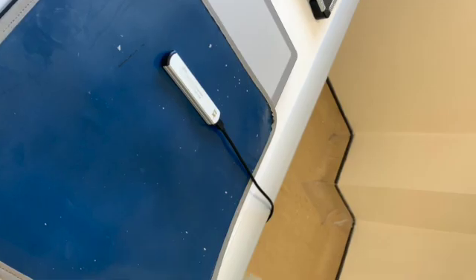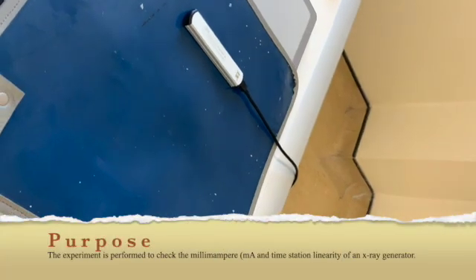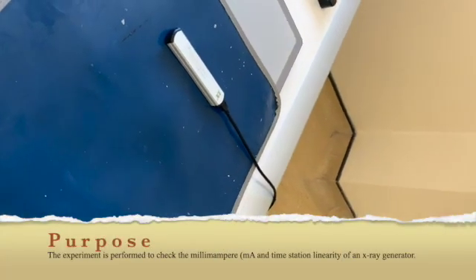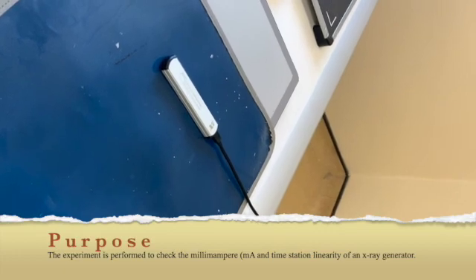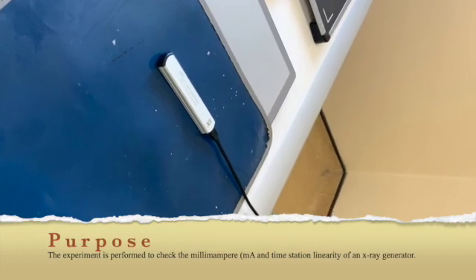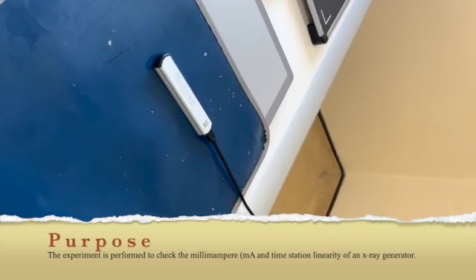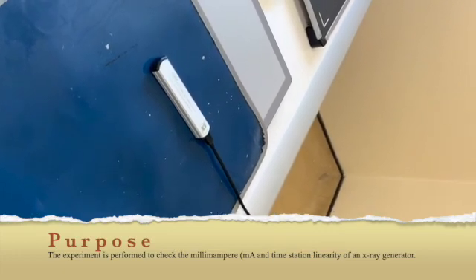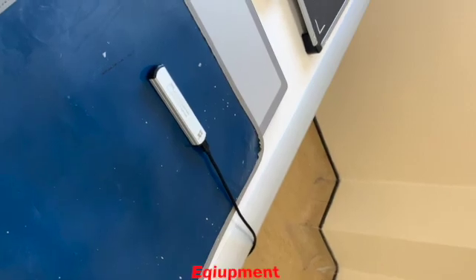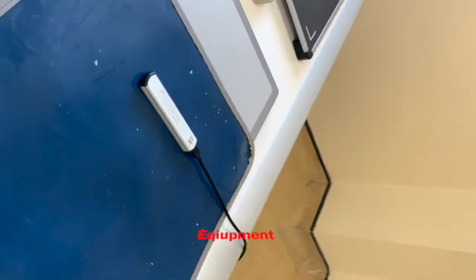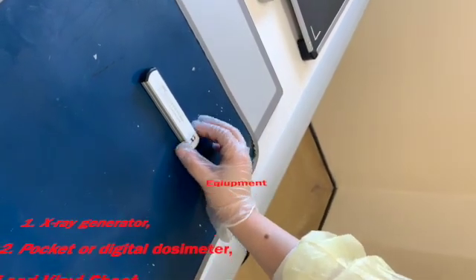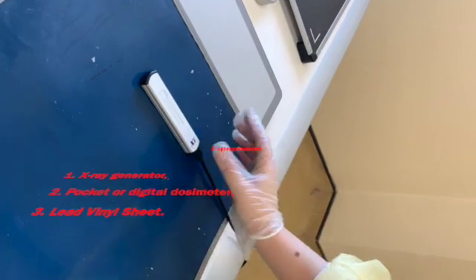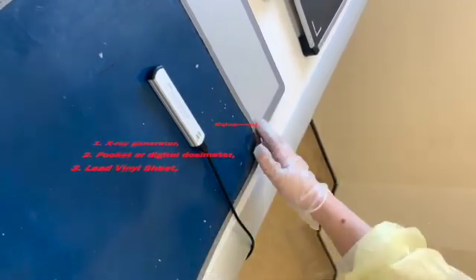We are doing experiment number two today, which is checking time linearity. For this experiment, we need an X-ray generator, which is the tube, a digital dosimeter, which is this device over here, and a sheet of lead vinyl with the IR.